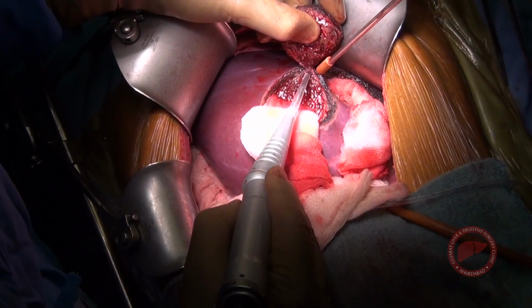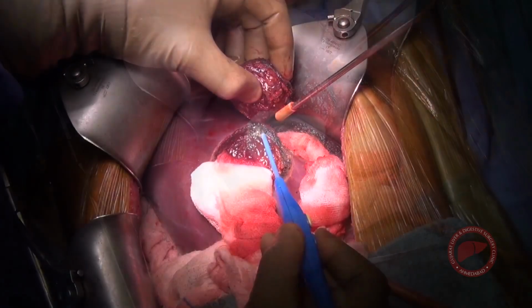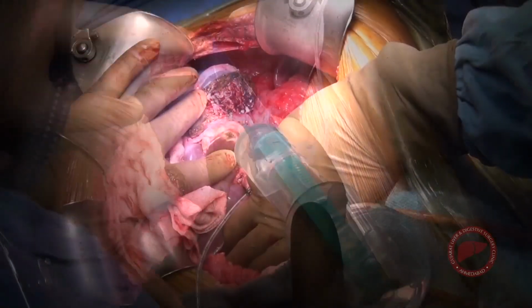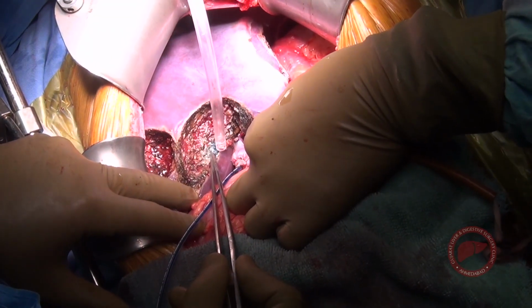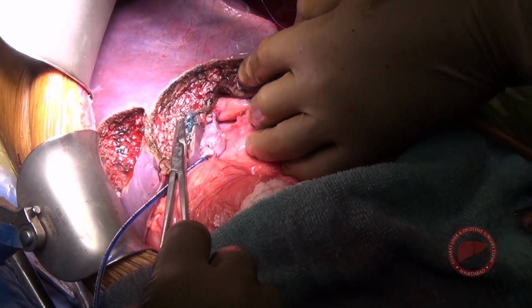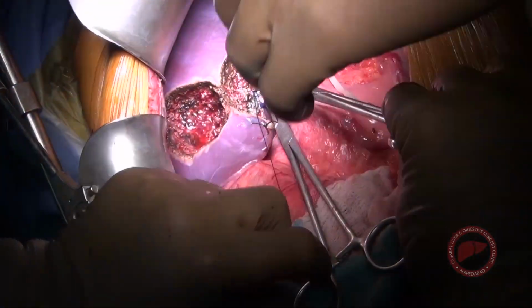You can see here the metastasectomy was completed. So that is the metastasis with clear margin. A methylene blue test was performed to look for bile leaks and a small bile leak was closed with the help of 5-0 PDS. The cholecystectomy was completed.